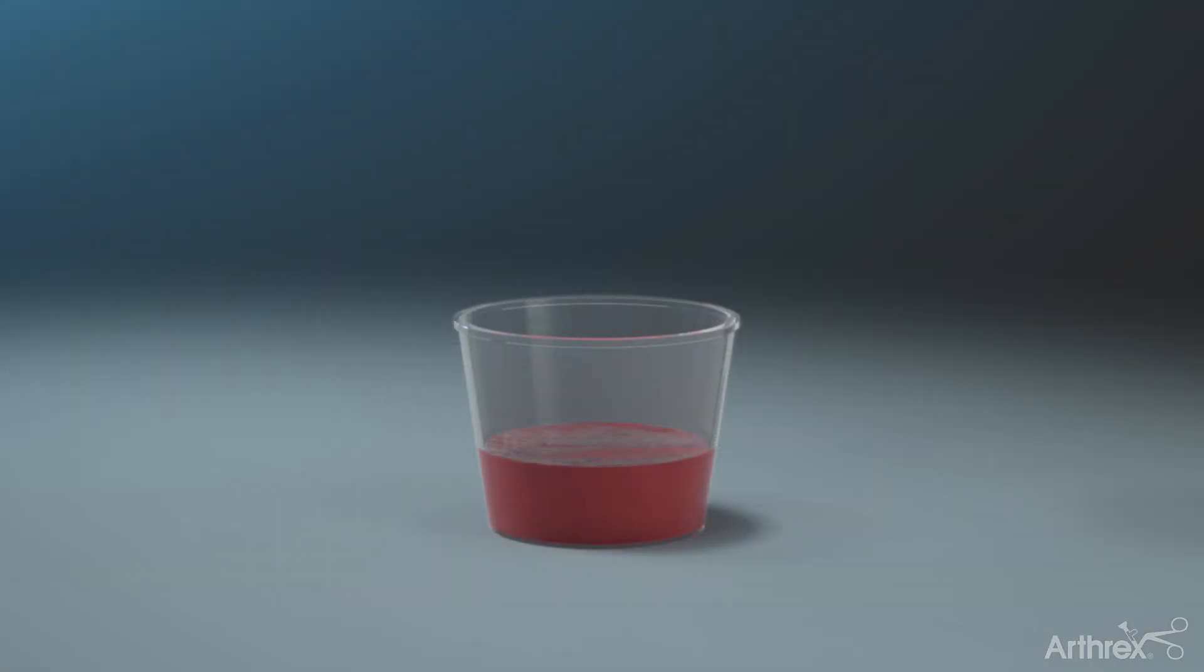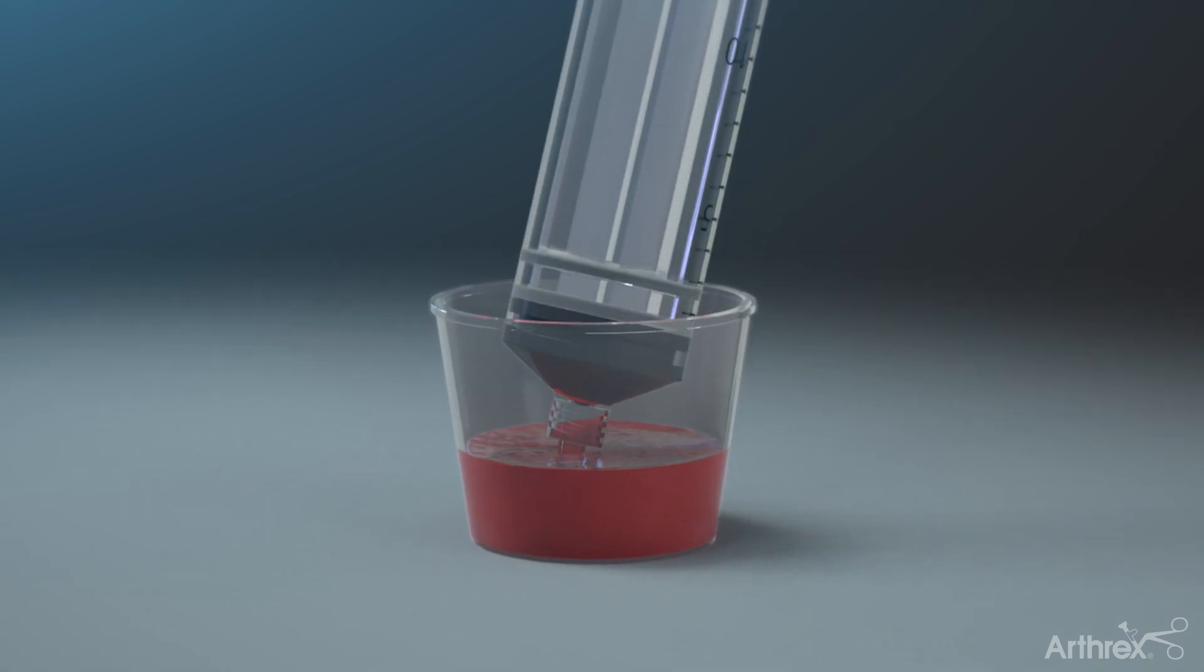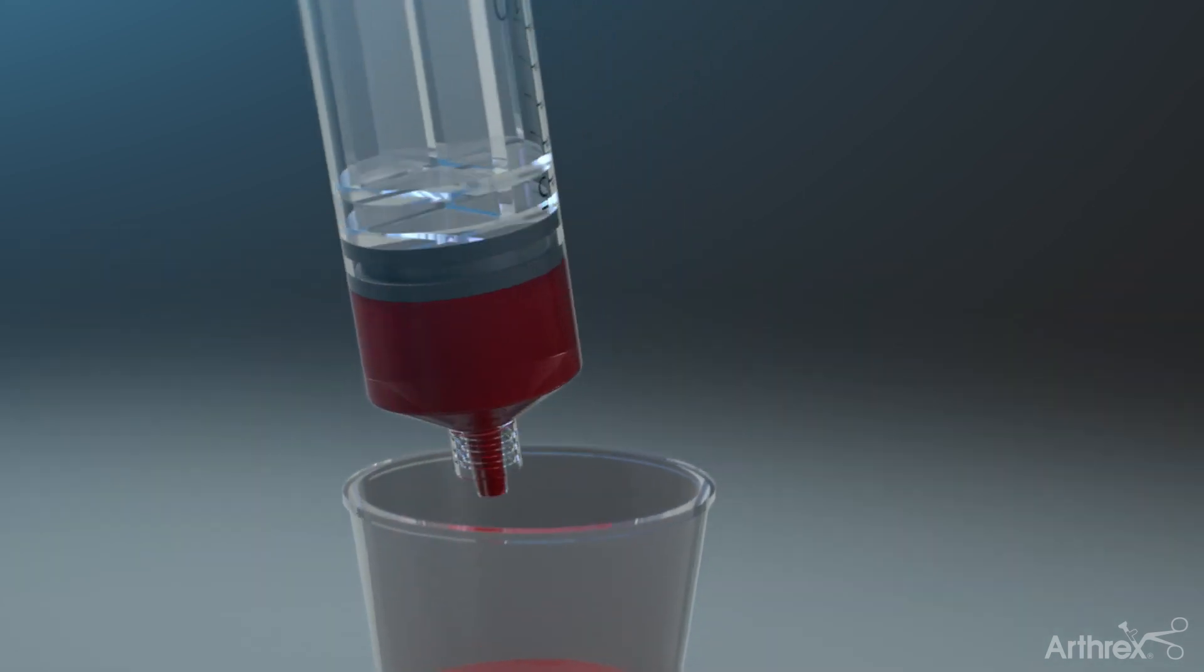To prepare the biologic graft to backfill the decompression site, the BMA is transferred into a separate sterile basin and drawn into a syringe.